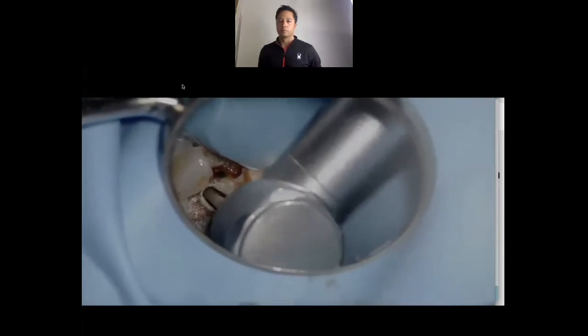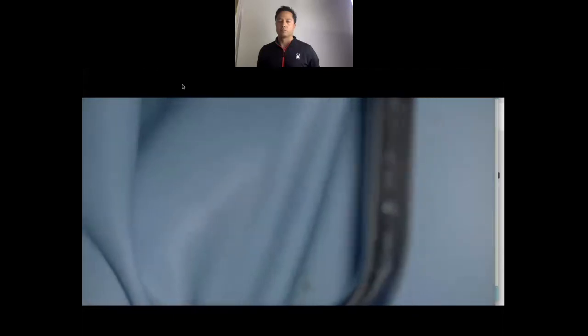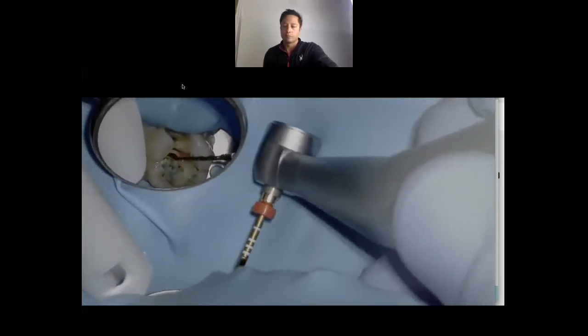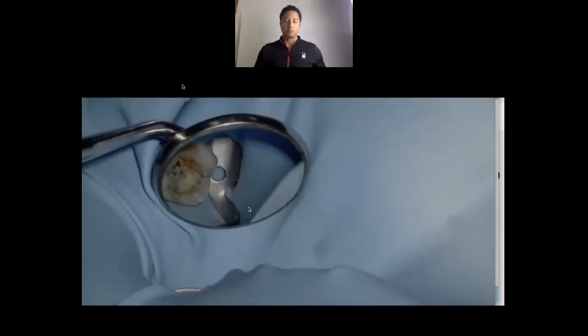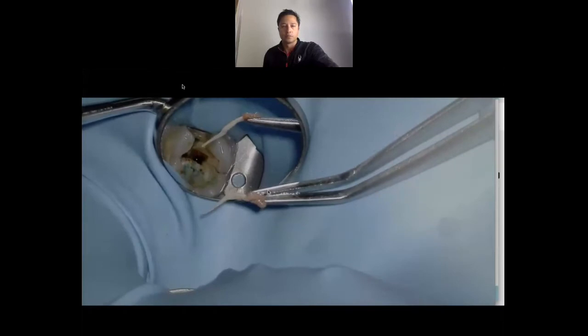We didn't have enough time to do complete therapy and wanted to see if we get some resolution of symptoms with just the pulpectomy before proceeding to finish the complete endodontic therapy — because there's always a risk of the endo in these cases and the tooth failing because of that crack. So I'm going to open up the orifice, open up the pulp chamber. The first thing I do is take my Wave and Gold primary file to open up my orifices. And we all know as dentists — it's some kind of weird thing when we get the full pulp out — it's actually quite useful.